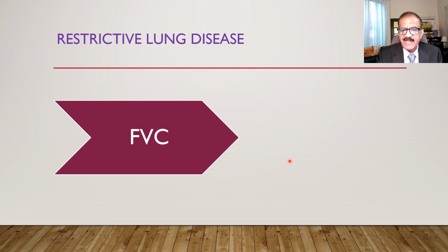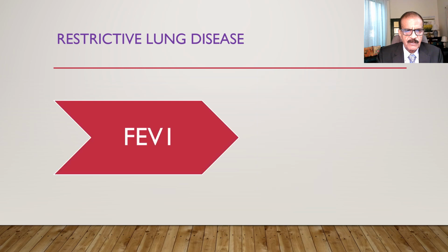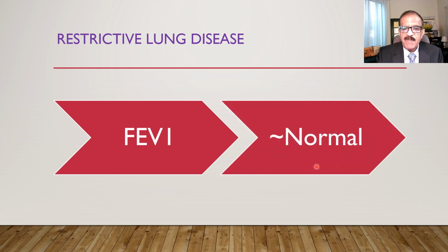Forced vital capacity is also reduced. It is only another form of vital capacity, so that is also reduced. What is FEV1? Forced expiratory volume during first second. This is going to surprise you. It may be normal.